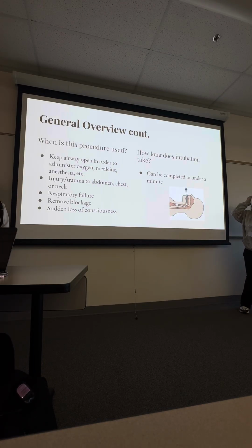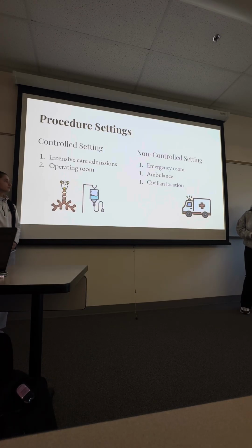It's commonly used to keep the airway open to administer oxygen, anesthesia, or medicine. It can also be used when there's trauma to the abdomen, chest, or neck, for respiratory failure, blockage during aspiration, or sudden loss of consciousness. And how long does this procedure take? In emergencies, it can be completed in under a minute.